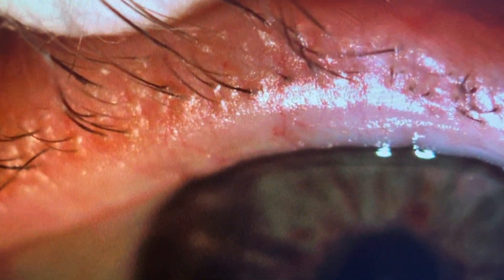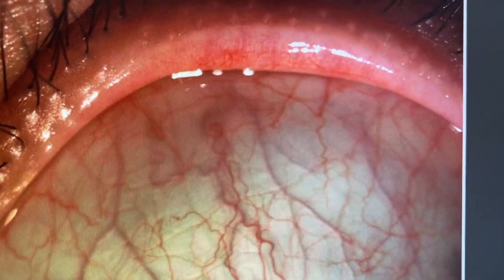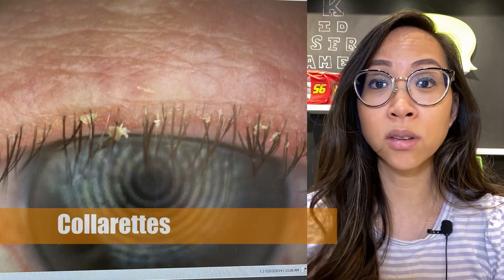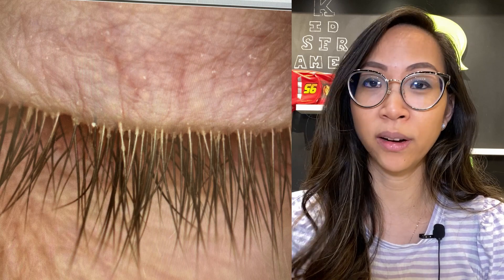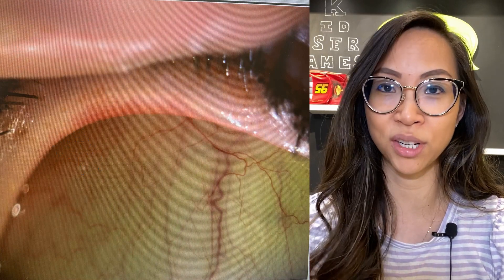Number two: lid margin and lashes. This is a great way to photo document structural changes of the lids such as scalloping, thickening, or keratinization. Telangiectasias or spider veins in chronic inflammatory dry eye really show up using this feature. It is also great at documenting bacterial buildup along the lashes — known as collarettes or demodex infestations — which build up as cylindrical areas along the bases of the lashes.